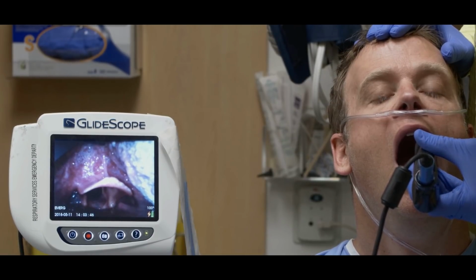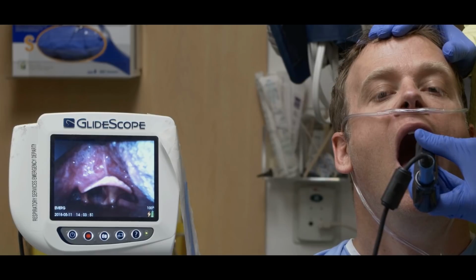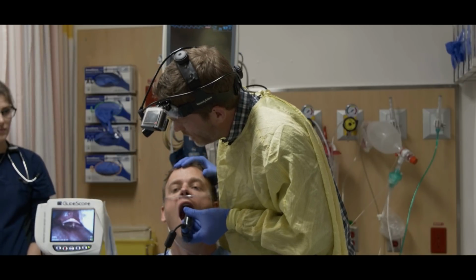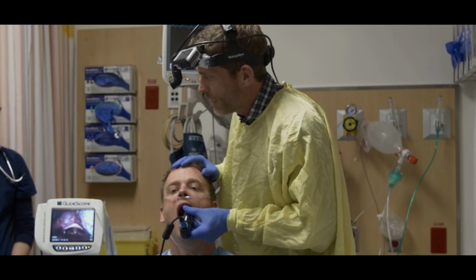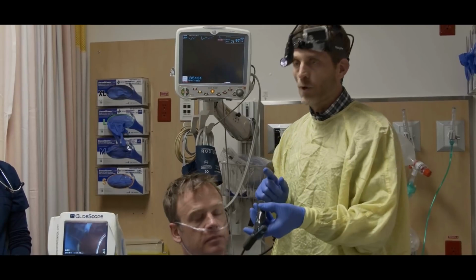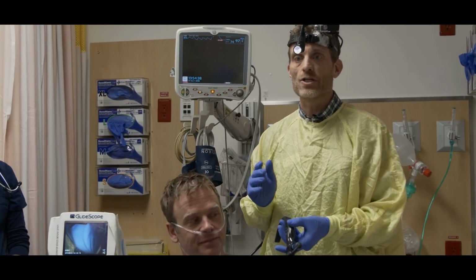Chad, if you can take a big breath in, so you can see how those cords will abduct when Chad does that. And just for the purposes of the demonstration, if I could have that endotracheal tube, we'll get it in the field of view, and we'll show you how we could easily do this procedure. We're not doing it today because this is purely a learning thing, but at that point, I would try and spray those cords a little more, and we'll get some subglottic anesthesia.